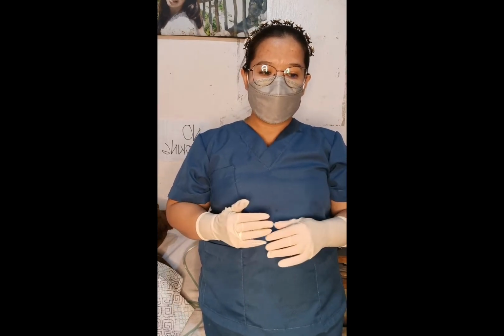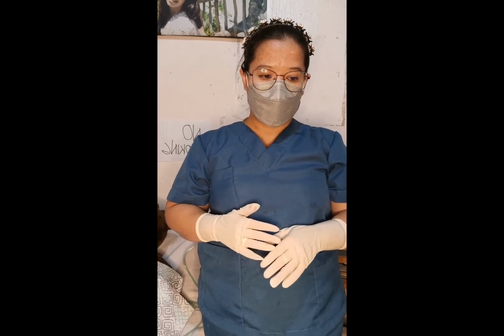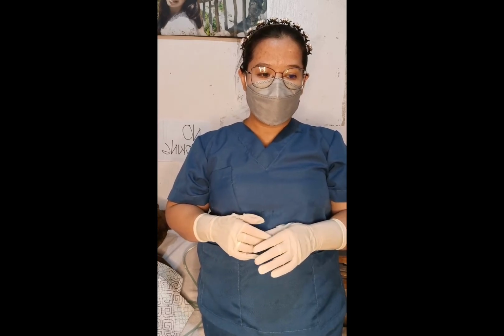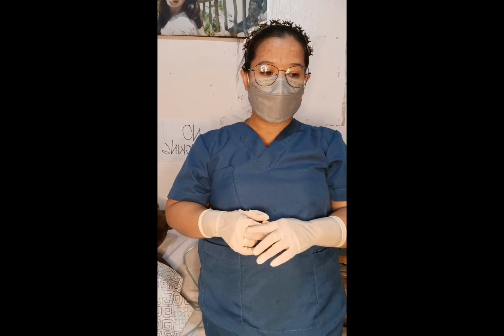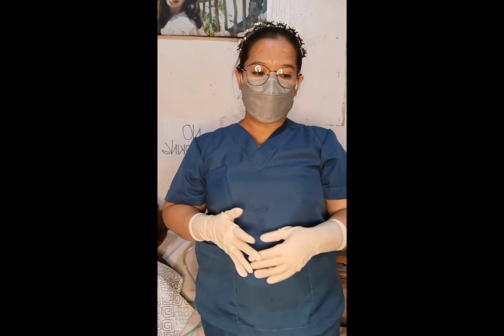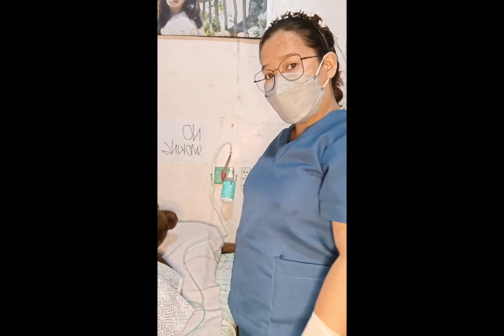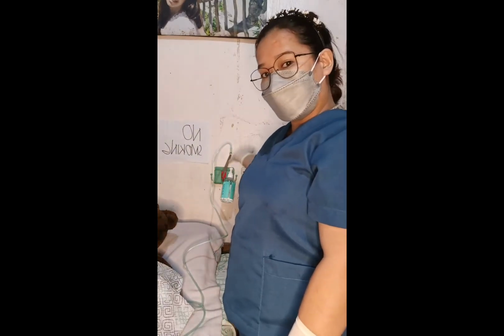We need to attach the oxygen tubing to the nozzle of the flow meter. If using a high oxygen flow, attach the oxygen tubing to the humidifier. Oxygen in high concentration can be drying to the mucosa. So let's assume that these are the equipment that we will be needing. It has already been attached.